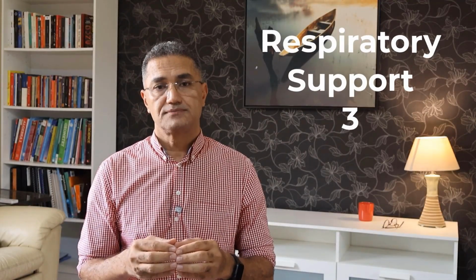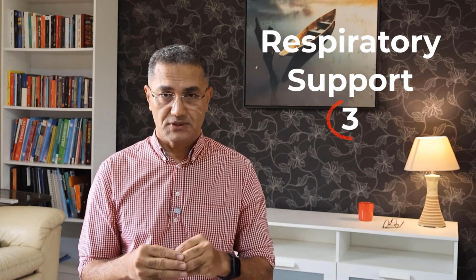So if you have patients, you might give them a mask at 6, and then you find the patients are still unwell, and you need to switch to a RAM cannula, you can do that. If you were giving 6 with the mask, make it 7 with the RAM cannula to achieve a higher effect because there will be a leak around the prongs. That was today's topic from the 3rd episode of the respiratory support series.